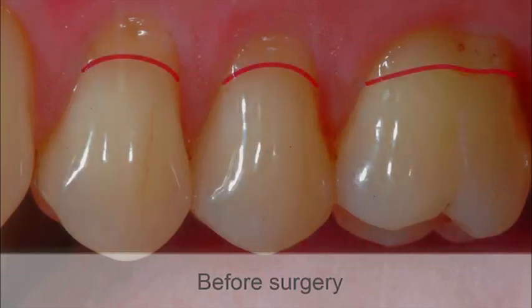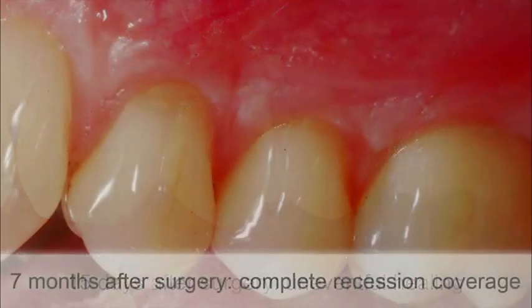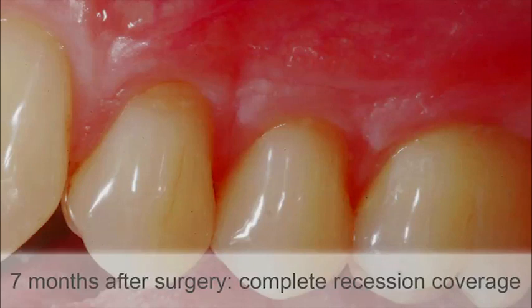Before surgery compared to 15 days after surgery: uneventful healing. At 7 months after surgery: complete recession coverage.